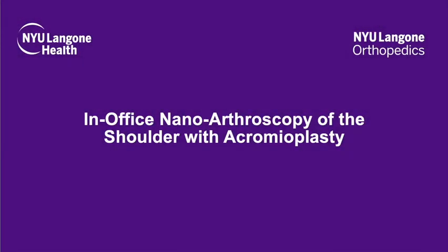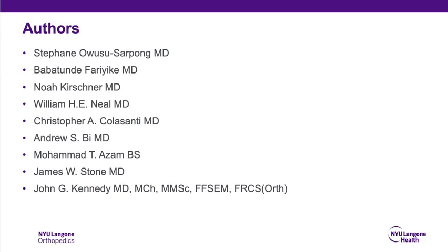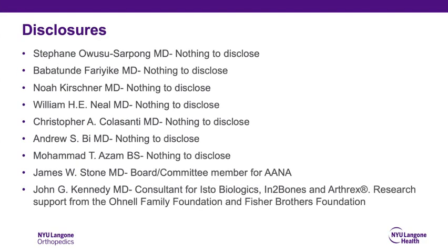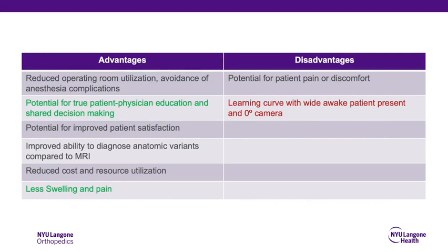The following is our technique for in-office needle arthroscopy of the shoulder with acromioplasty. The advantages of the technique include the ability to obtain real-time assessment of pathology, avoiding complications of anesthesia, and a fast recovery.